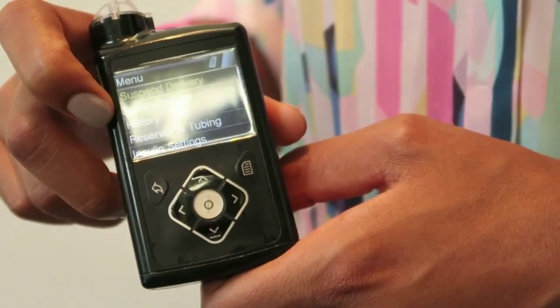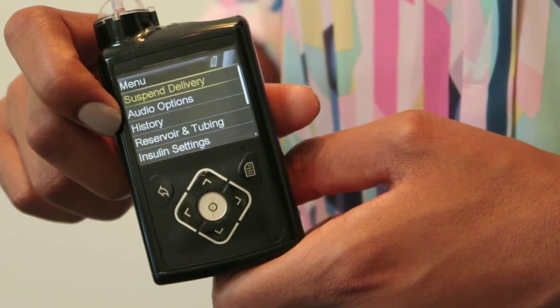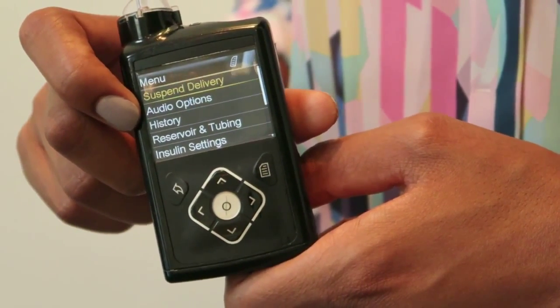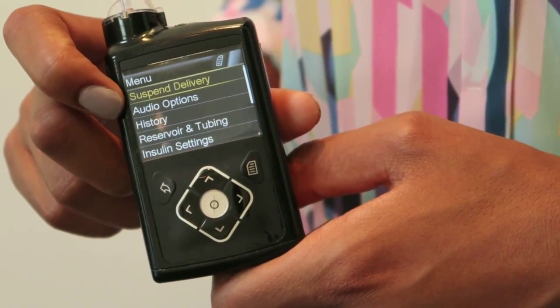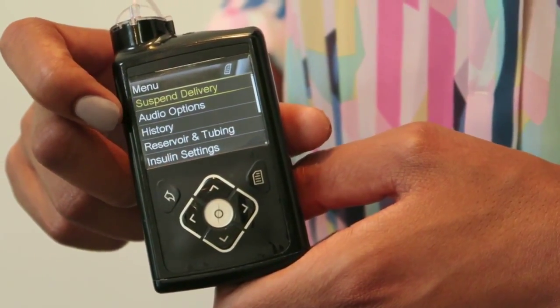You've then got your audio options. Because you're wearing the sensor and you set parameters for your glucose levels being too low or too high, this option tells you whether you want the pump to make a noise and alert, whether you want it to vibrate, or not to do either at all.